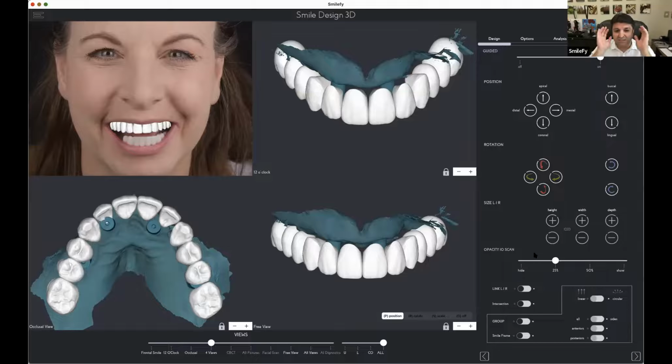So all these facial driven smile design, even if it's a full arch implant bridge, the idea is to have the design with the face, the harmony with the face, everything with the face. And then we plan backwards and see where is the position of the gums, where is the position of the prosthesis, and we plan actually backwards until the smile is in the perfect position.